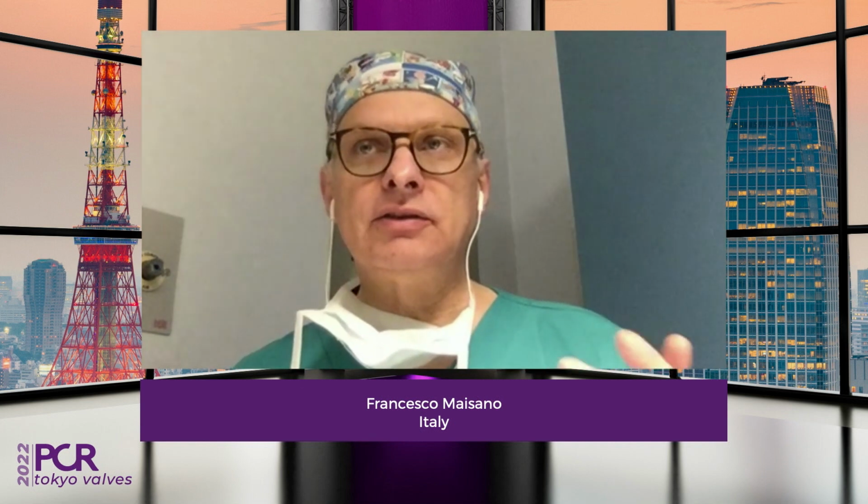The other important issue here is to interpret the line of coaptations. You need to identify, if possible, the chordal-free zones which are present in the middle of each leaflet. That is the challenge. For mitral, it's very simple. You go in the middle, A2, P2, you find no chordae. In the tricuspid leaflets, you need to interpret mostly what you see in transgastric. You can use a couple of landmarks.